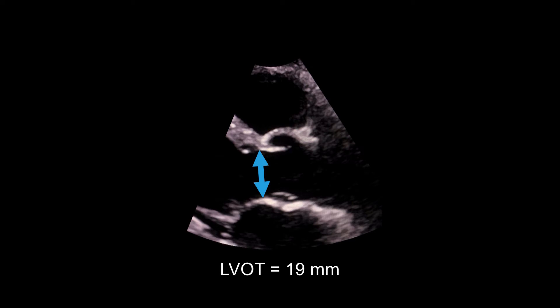Caliper measurements can then be applied to measure from the inner edge to the inner edge of the outflow tract in mid-systole. Ideally, three or more beats should be measured for patients in sinus rhythm, with more used for those in an irregular rhythm. In this example, the LVOT measures 19 mm.